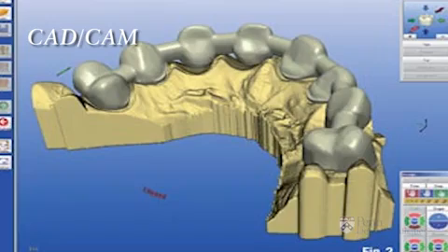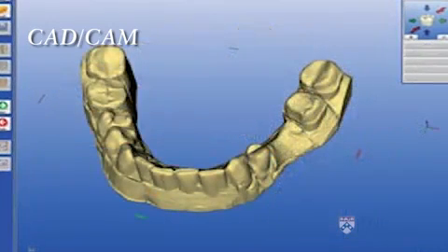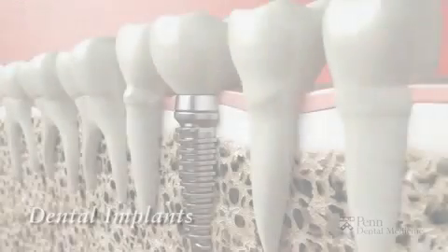This process involves identifying the appropriate color, shape, and biting chewing surface for your restorations. The design then is sent via cable or wirelessly to a milling unit in the dentist's office that will fabricate the restoration in approximately 20 minutes. This technique also enables a dentist to use a camera to create a digital impression, thereby circumventing the traditional impression, which is generally not very much favored by the patients.